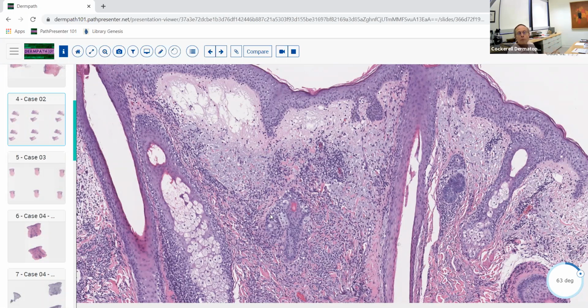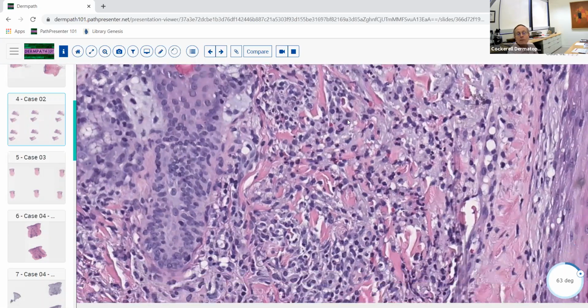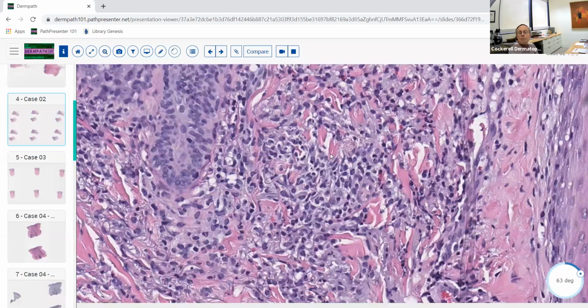So interstitial infiltrate with neutrophils, if it's a sprinkling of neutrophils, it's probably something more like neutrophilic urticaria or some of the neutrophilic inflammatory dermatoses patterns, things like familial Mediterranean fever, and the type of neutrophilic infiltrate you can see in lupus. If it gets more nodular and diffuse, then you think of Sweet's. If it gives you this relatively diffuse infiltrate, but denser than the inflammatory dermatoses, you should think about cellulitis or erysipelas. And you may get a few other cells besides neutrophils here.